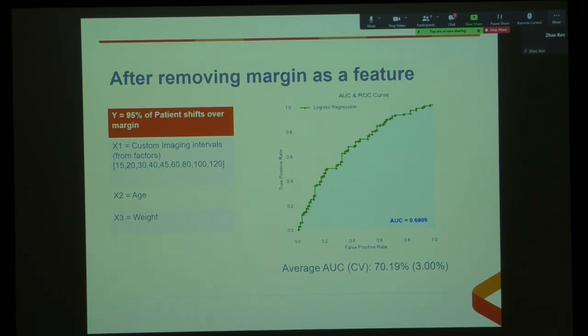Do you know what the accuracy and precision of the motion movements is? What do you mean? So if it records a 1 mil shift, how close to a mil is it? I believe, so I asked Gosha about this the other day, and I believe her response was 0.01. It's very accurate, the CyberKnife. Is she quoting the manufacturer, or has she done a measurement on that? I think that's the manufacturer. But don't take my word for that, I will need to confirm that.